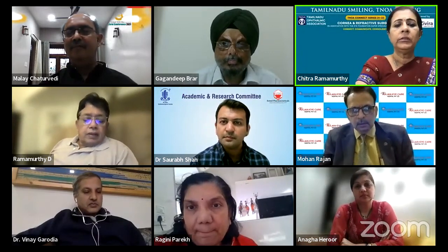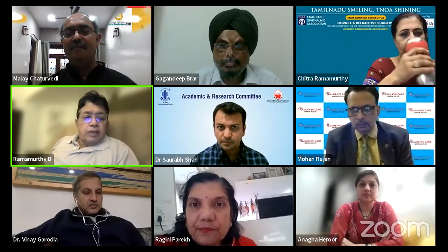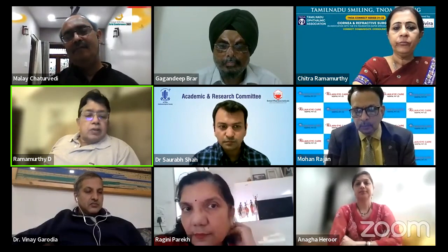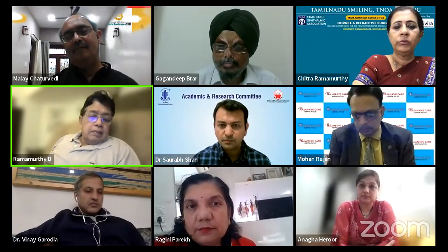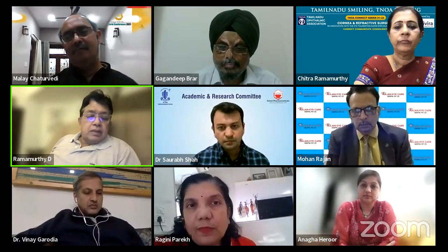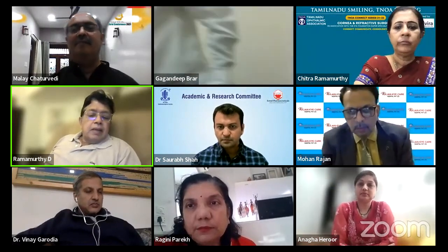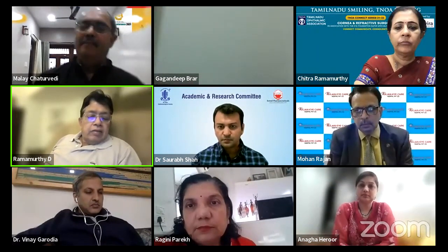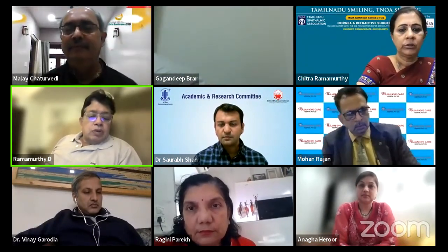I sort of agree with Ragini in the sense that most often, fortunately, we don't face this situation. And if at all, quite often you are pleasantly surprised that on the table you think there is a PC plaque, there's a PCO, but then the patient has reasonably good vision post-operatively, and it bothers the surgeon more than the patient, and we can just leave it aside. And maybe later on, a couple of years later, if PVD has occurred and then subsequently we do a YAG laser, it is quite safe.